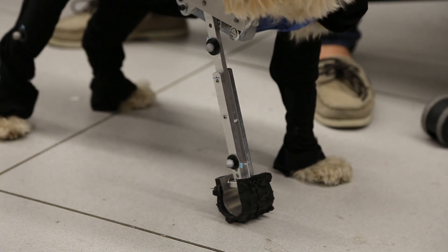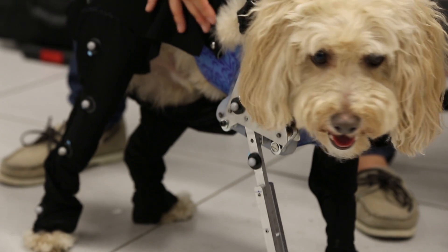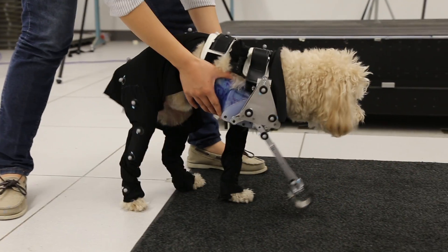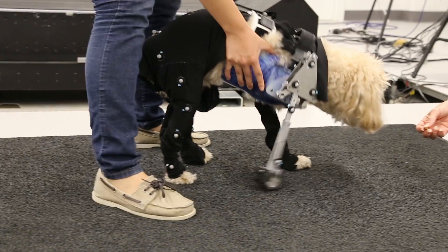Jimmy lost his entire limb, so we needed a harness to attach a bionic leg to it. The entire bionic leg was created by Ohio State engineers, except for the harness, which was made by Animal OrthoCare in Virginia.